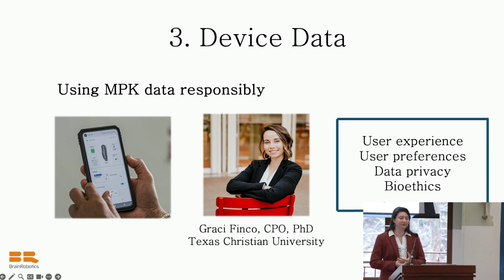The third and final track uses the knee itself as a research instrument. Because the knee continuously captures IMU data, parameter settings, and usage statistics, we have the potential for longitudinal data at a population level, the kind of patterns that no lab study can capture on its own.